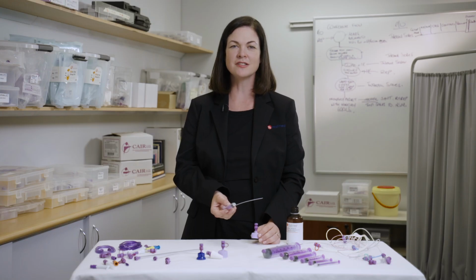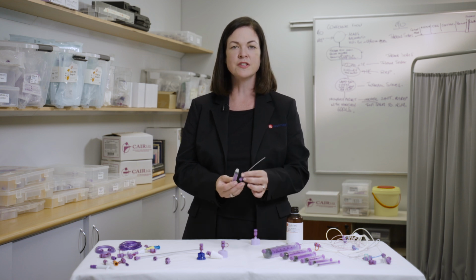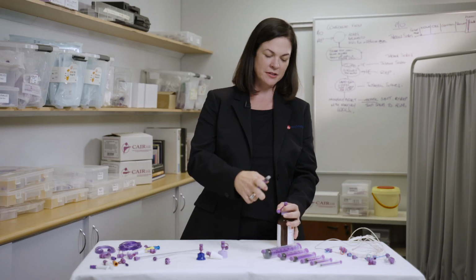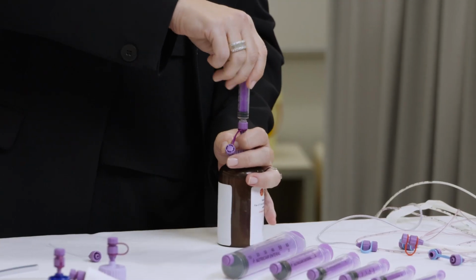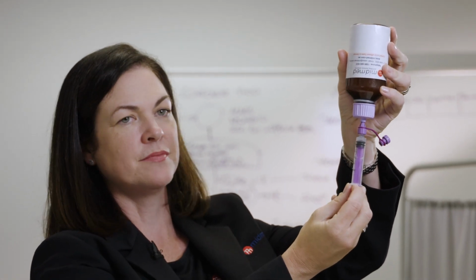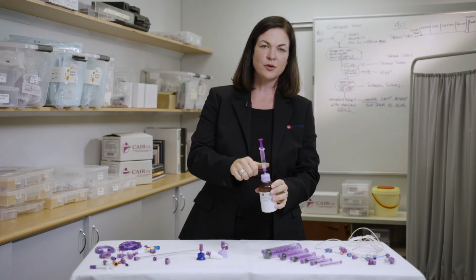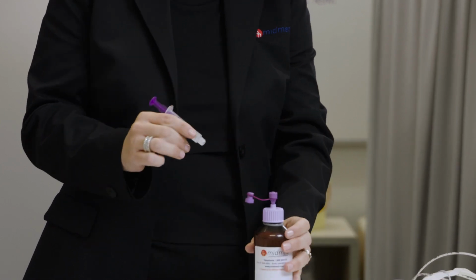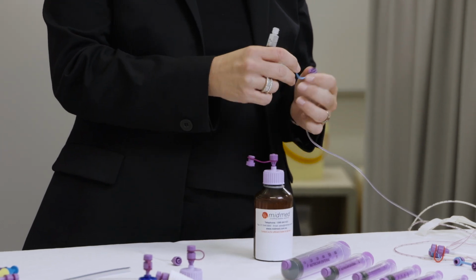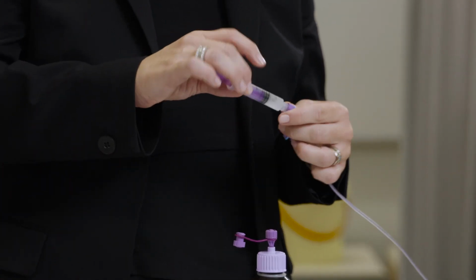To ensure precise dosing administration, when drawing up liquids to be given enterally, either a sampling straw or fitted bottle cap should be used. When using the attached bottle cap, attach the syringe to the bottle adapter. Turn the medication bottle upside down and quickly cycle up and down to remove any air bubbles. Pull the plunger back to desired dose. Turn the bottle right side up and remove the syringe. Move to the patient and connect the female Enfit connector of the syringe to the male Enfit connector at the patient's side and administer.